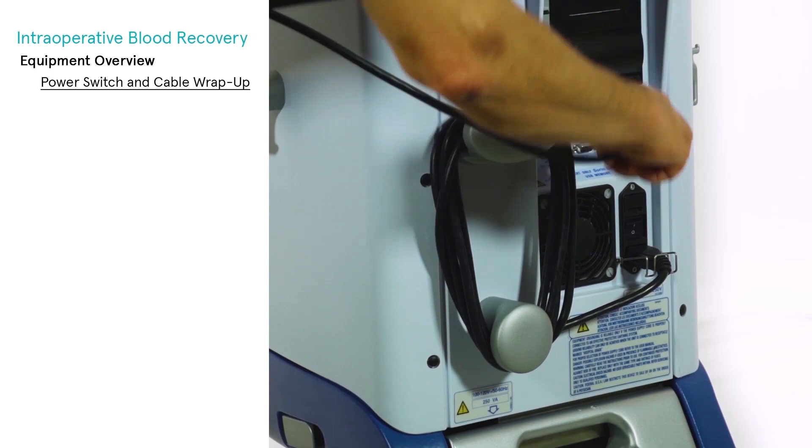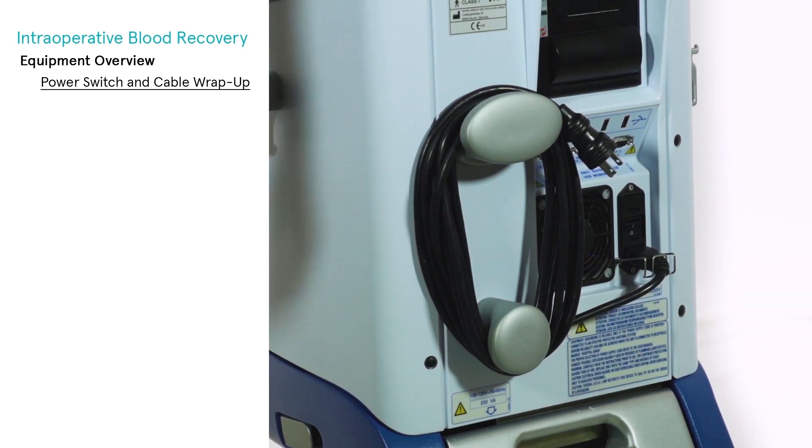When the Extra system is switched off, the power cord can be wrapped around the supports located on the back of the machine.